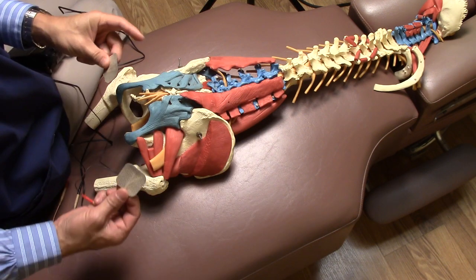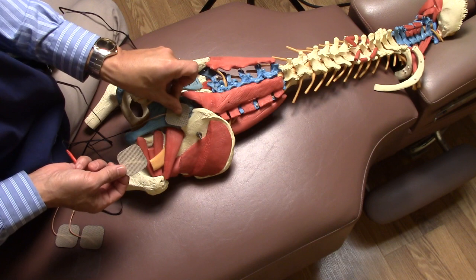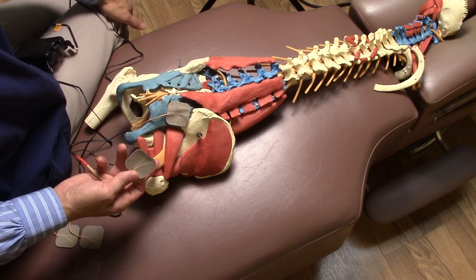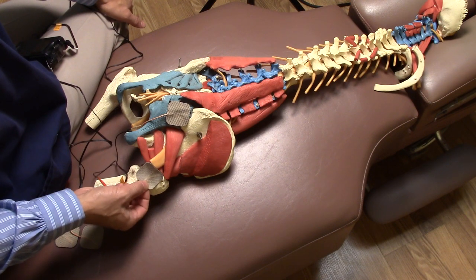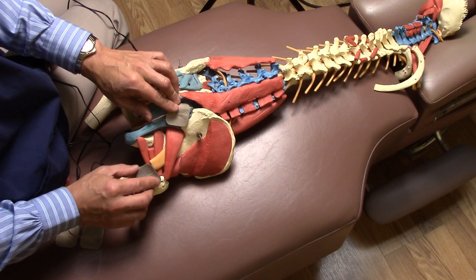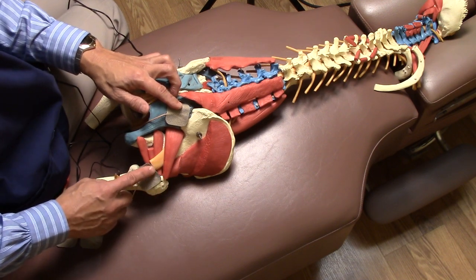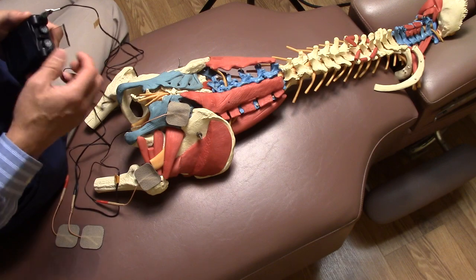If you have sciatica, try putting one electrode at the start of the piriformis muscle — that's the muscle right on top of the sciatic nerve — and the other one at around the lower level. This encompasses the length of the piriformis muscle and the sciatic nerve underneath it. Place them, turn on your unit.